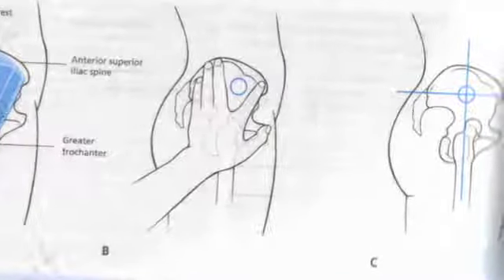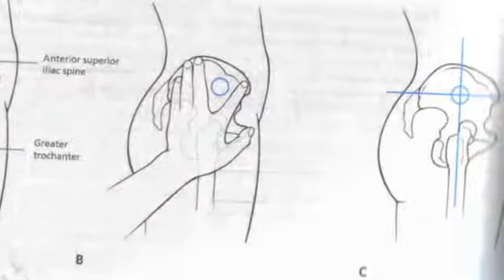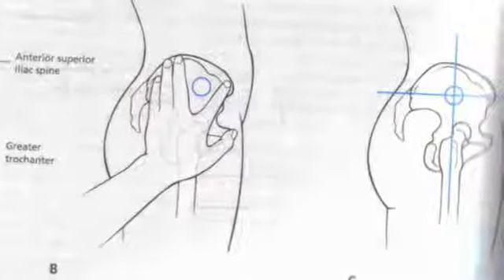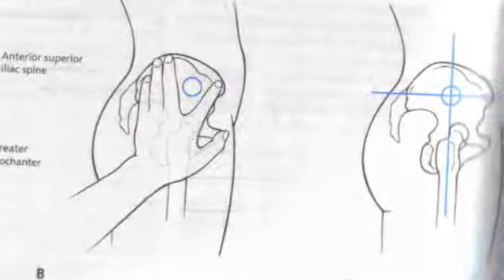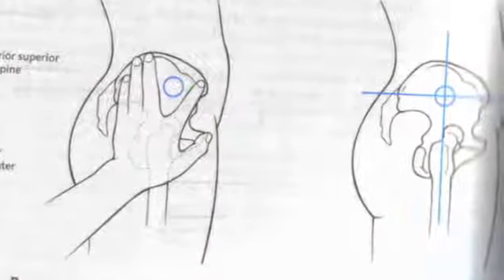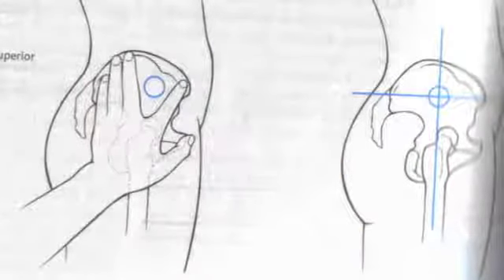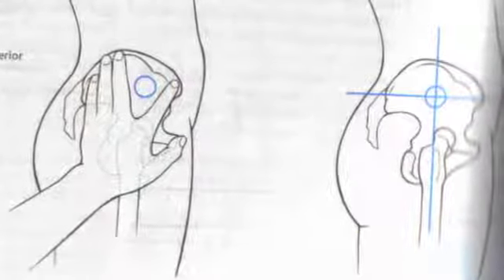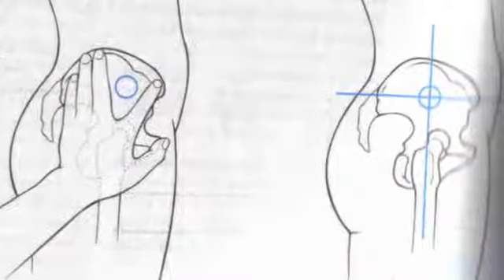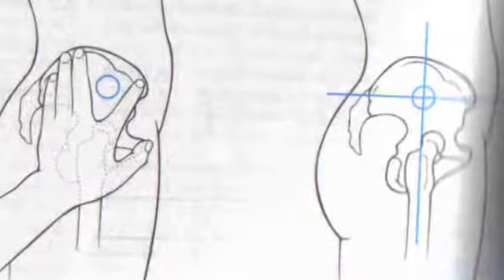There are many ways to locate this area. However, I find that the easiest to locate for self-administration is the diagram on the far right of this picture. Find the greater trochanter of the hip, which is the bony protuberance of the hip, and find a point about halfway between the trochanter and the top of your iliac crest. The injection site is located about halfway between these points, just slightly posterior to this.